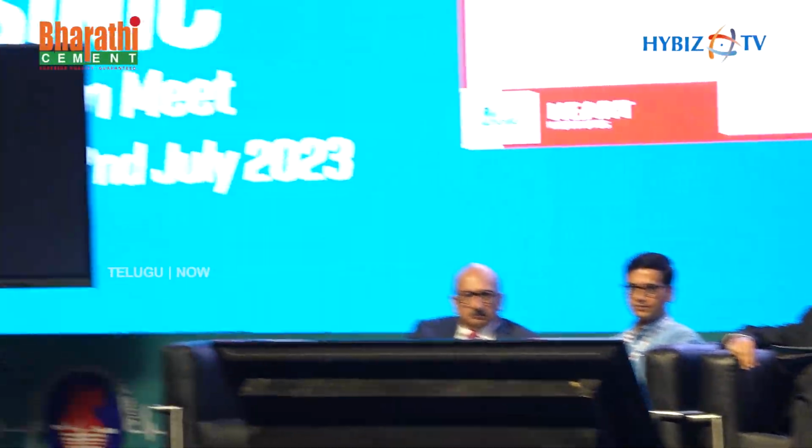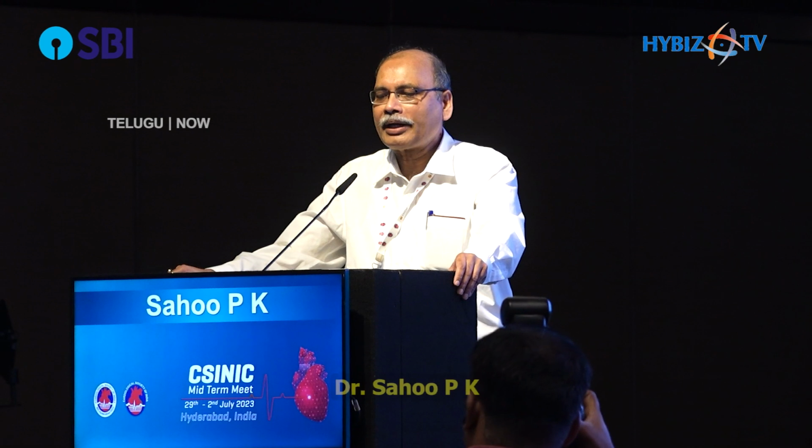Now, when do I do a kissing balloon dilatation? Two situations. One is a provisional strategy to address the side branch, or when I use a double stent to do a kissing balloon dilatation. These are the two situations. Let us take the first situation, provisional strategy, whether to address the side branch with a kissing balloon. To kiss or not to kiss is a big dilemma, as I'll show you what the scenario is like.